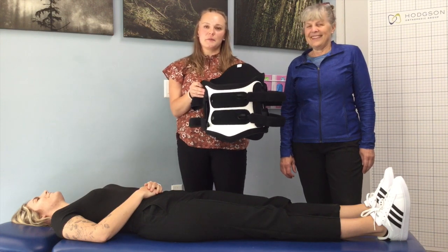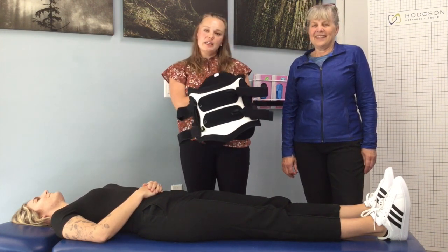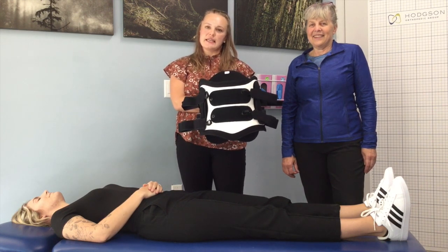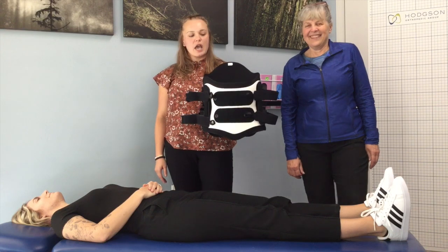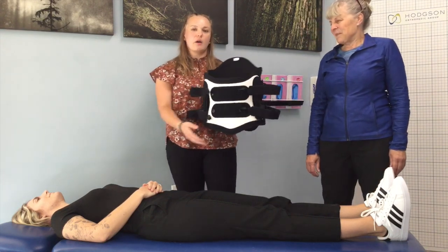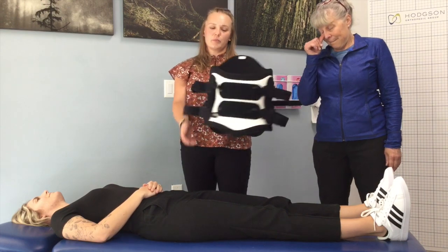Welcome to Hodgson Orthopaedic Group. I'm Amber, a certified orthotist. To my side I have Pauline, who's also a certified orthotist. Our patient today is Nikki, an orthotic resident. We're going to show you how to put on a lumbosacral orthosis, also known as an LSO brace.